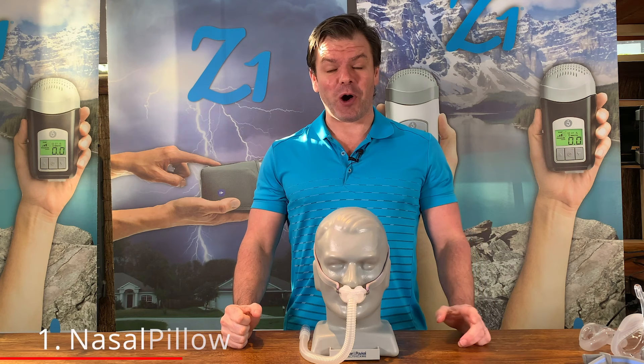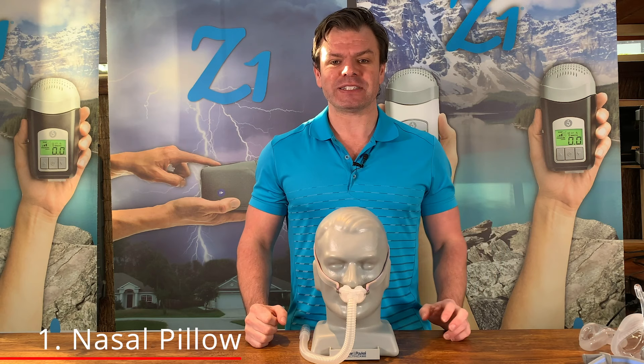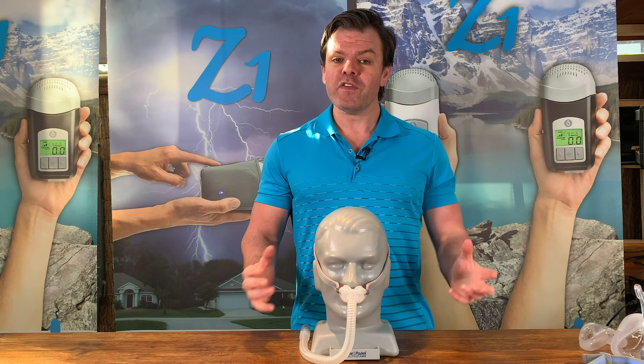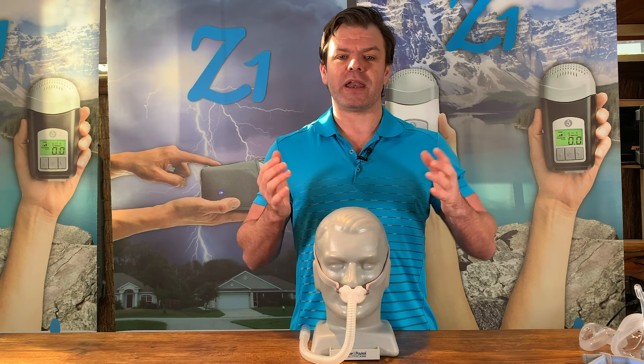The first mask style we're going to talk about today is the nasal pillow mask or pillow mask. A pillow mask seals at the nostrils - it has these two little prongs or pillows that gently push up and seal at the nostrils. The reason I love the nasal pillow mask so much is that they're so small, lightweight and minimalistic. When you're moving around overnight in bed, you don't feel like you have this big cumbersome mask on. It's very light and very easy to maneuver, and it's very easy to put on and take off.